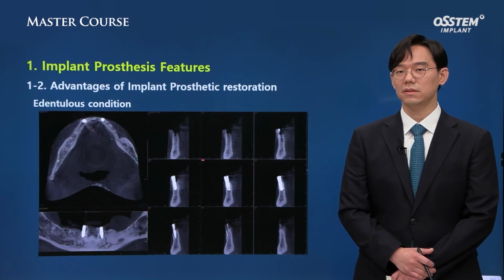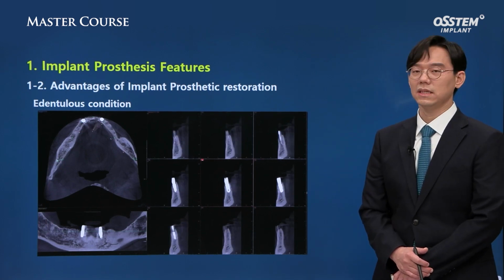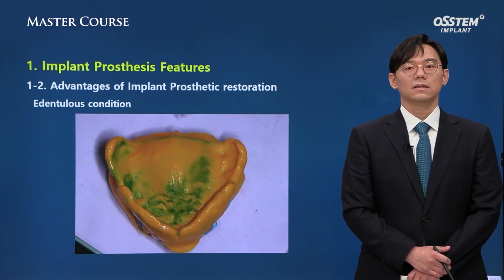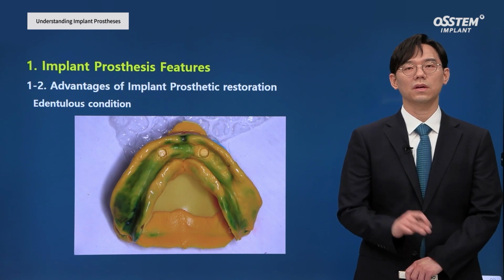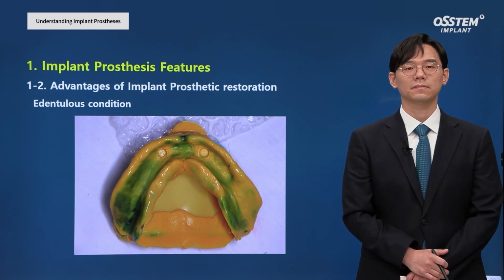This is implant section image. This is the right and left after placement. I tried to place the implants parallel to each other. As for the upper, impression for full denture treatment was taken. And for the lower, locator and housing were connected and impression was taken.